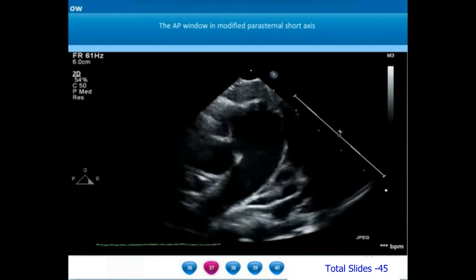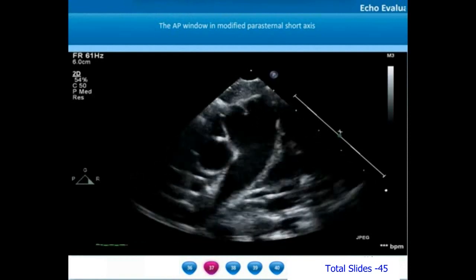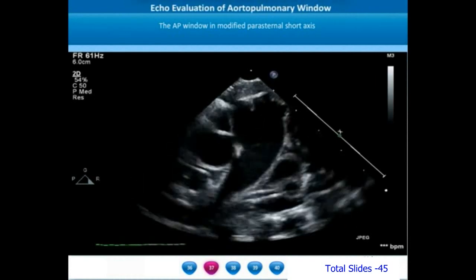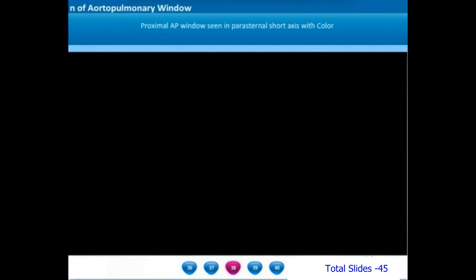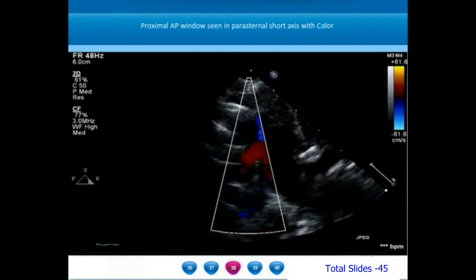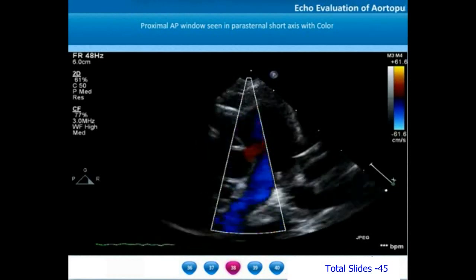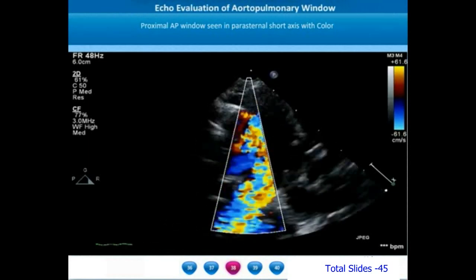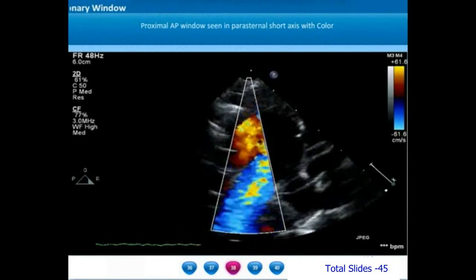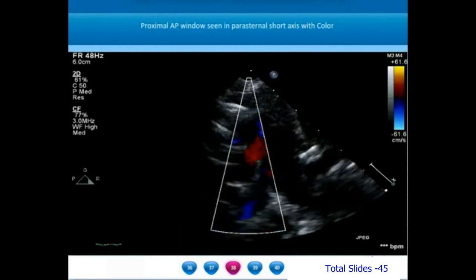On a parasternal view, the right pulmonary artery is arising in continuity with the main pulmonary artery, unlike in previous patients with distal AP window where the RPA arose from the posterior wall of the ascending aorta. Color flow interrogation on parasternal short axis shows a large proximal AP window with laminar color flows from the ascending aorta into the main pulmonary artery in red. The right pulmonary artery is clearly arising as a continuation from the main pulmonary artery, and the aortopulmonary window is not extending up to the PA bifurcation — this is a classical appearance of proximal AP window.